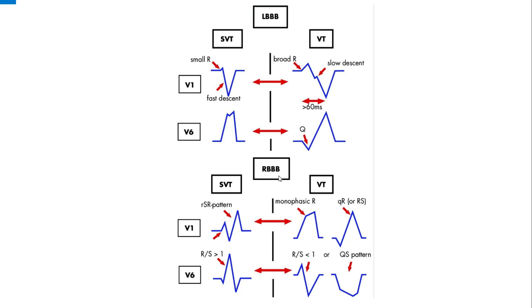If the ECG shows a right bundle branch block (RBBB) morphology, then for the rhythm to be SVT there should be a small R, then S wave, and a terminal R-prime in V1, along with a tall R and small RS in lead V6 with an RS ratio of more than one. For the rhythm to be VT with RBBB morphology, a presence of a monophasic R wave in lead V1, or a small Q and tall R wave in lead V1, along with an RS ratio of less than 1 in V6 suggests ventricular tachycardia.